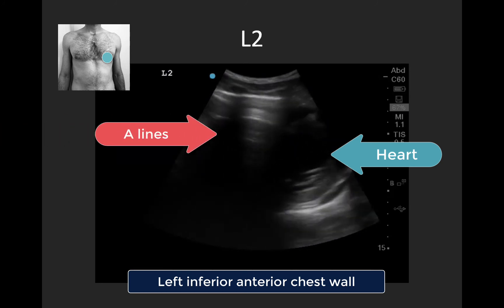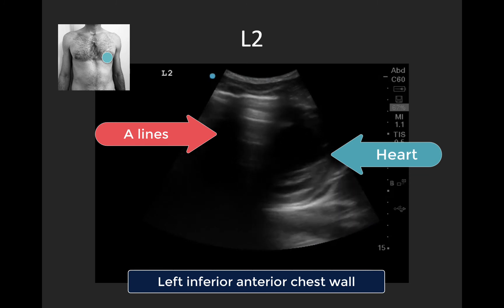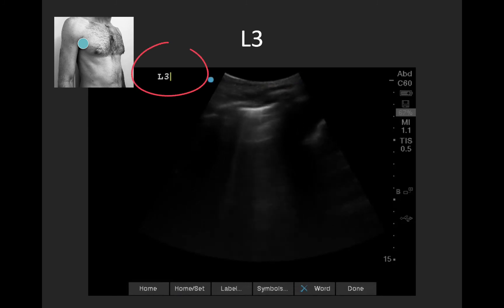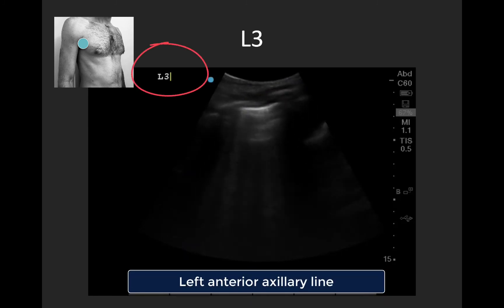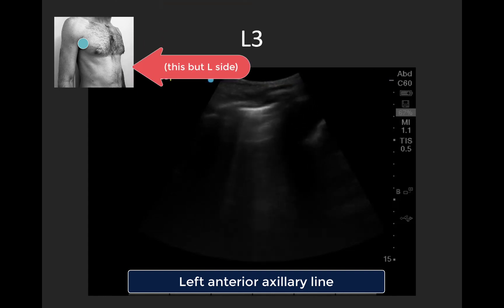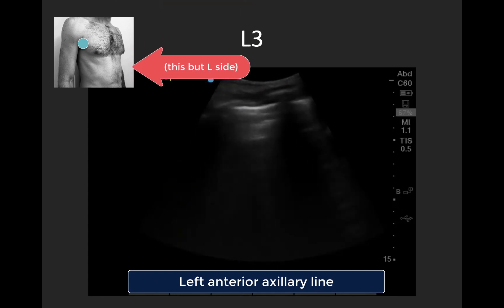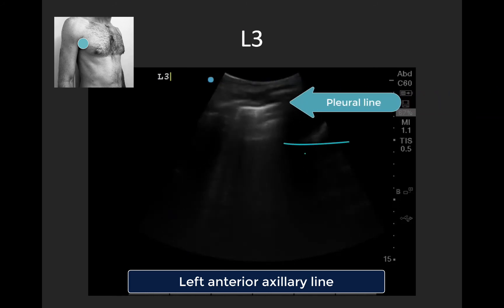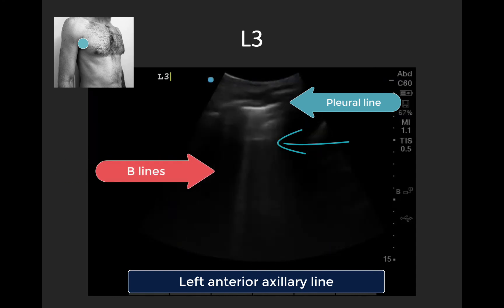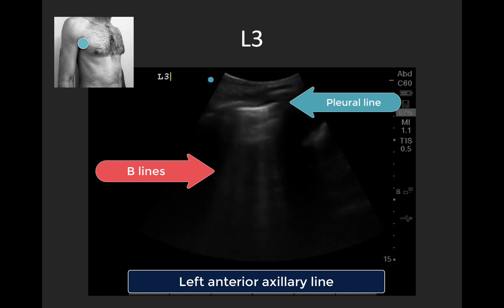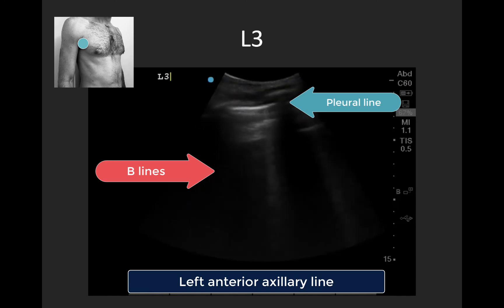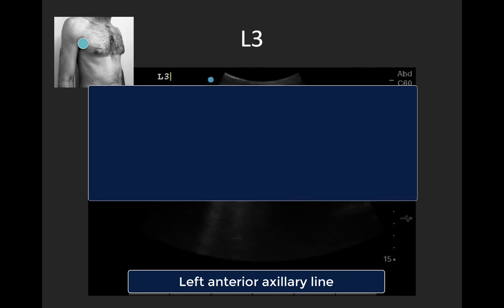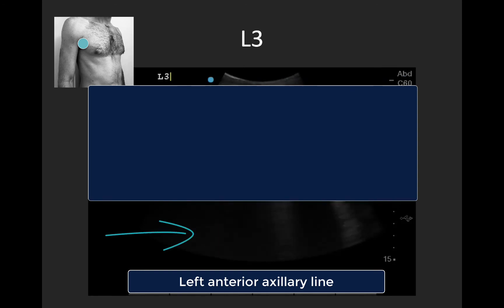Now we're in L3 — the left anterior axillary line right up in the axilla. In our centered rib space, we can see a bright pleural line, one little A-line, and then a few B-lines coming in and out of the picture with respiration. If you're unsure whether you're seeing true B-lines or Z-lines — those vertical artifacts that don't reach the bottom of the screen and don't represent interstitial pathology — a nice trick is to cover the top half of your screen and see if you still see movement of the B-lines at the bottom.